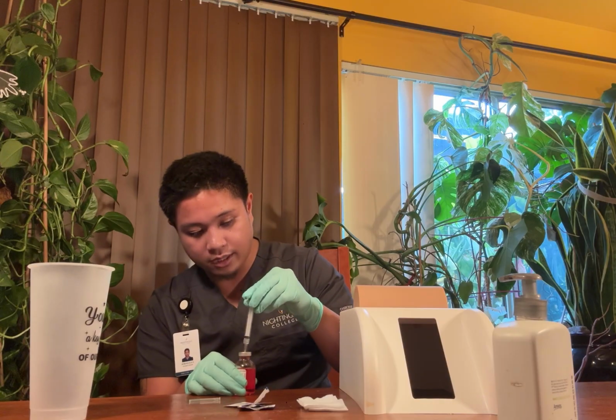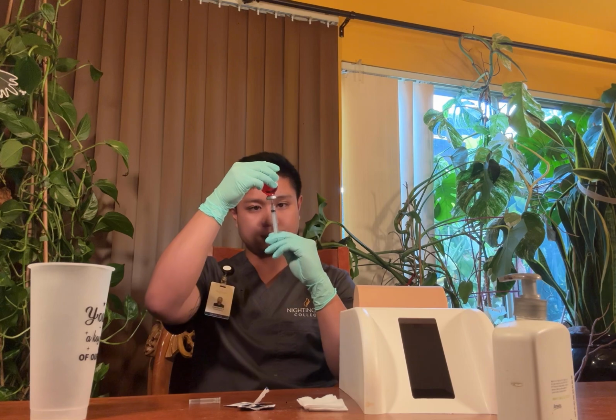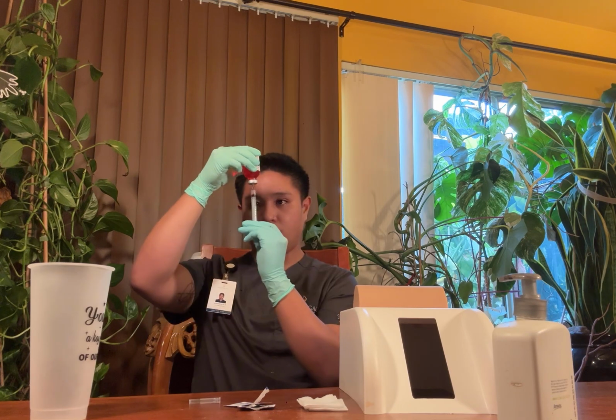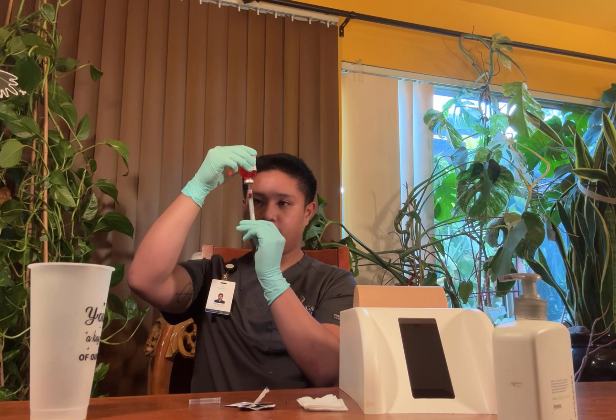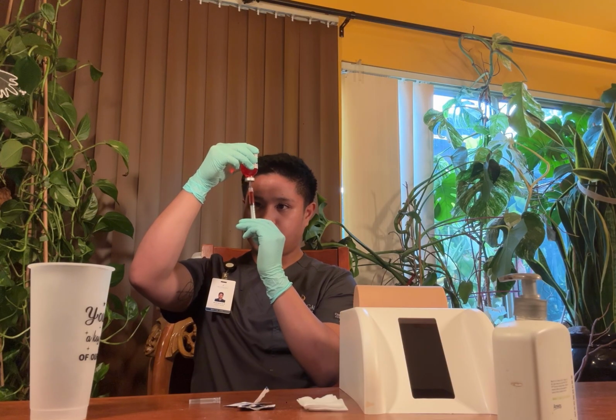Once that has been completed, we're going to flip the vial upside down, and then I'm going to draw 1.5 milliliters of morphine. I'm going to go slightly over and then push back to get rid of some of that air.